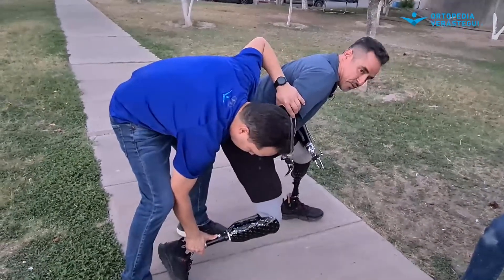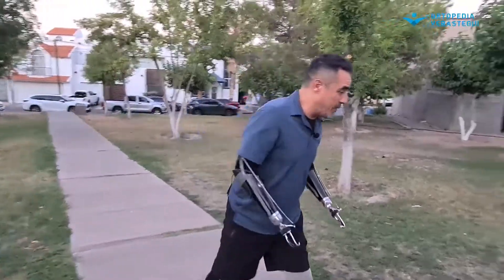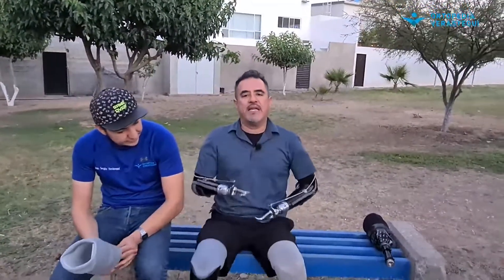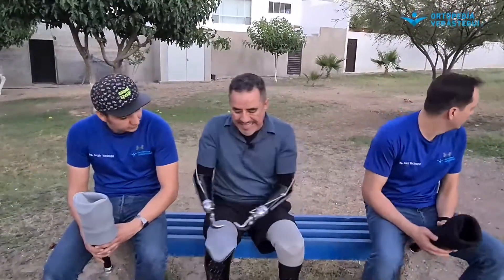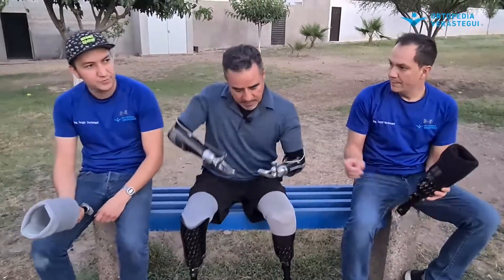Con este puedes doblar todo eso, no es tanto rollo, te levantas y no perdiste nada de vacío. Eso también es la ventaja mental que tiene esto, porque al final de cuentas es lo que uno al día a día le sirve. Sentadito aquí, si duré mucho tiempo, esta pierde más vacío que esta; esta me levanto y sin problema. Esta tengo que hacer un ligero ajuste, bajar el muñón, acomodarlo, ganar vacío otra vez.